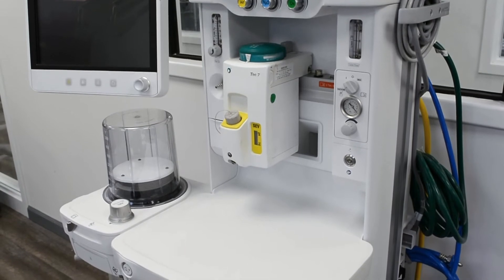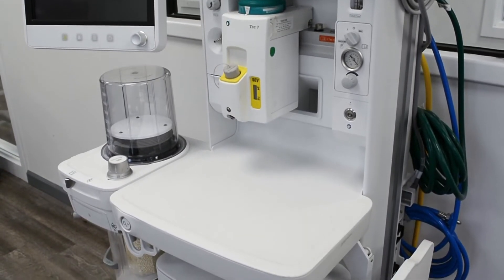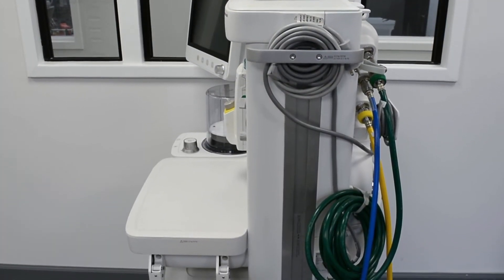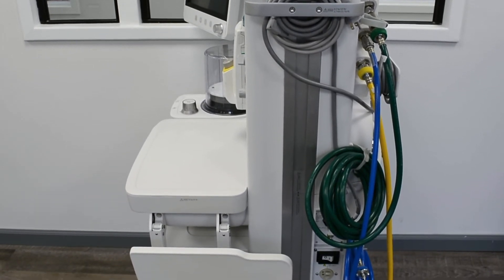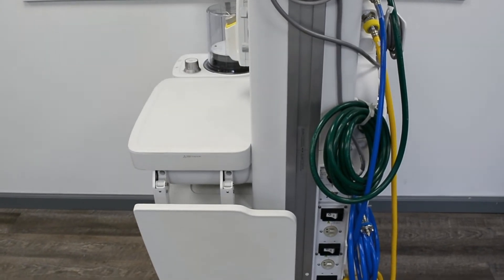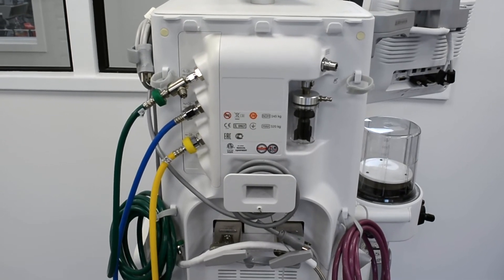This CareStation anesthesia system is equipped with an easy-to-use 15-inch touchscreen ventilator display, large casters for easy mobility, and easy-to-clean surfaces. The 620 is part of the CareStation 600 series anesthesia machines, and has ergonomic and intelligent lighting controls that offer visible and tactile reinforcement where auxiliary ports are in use.